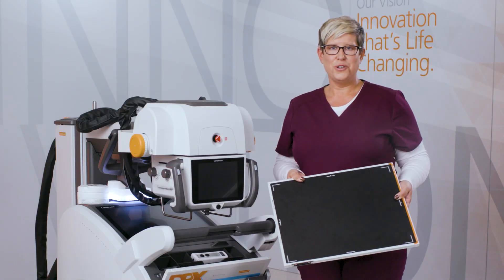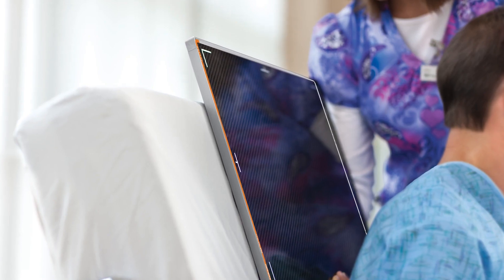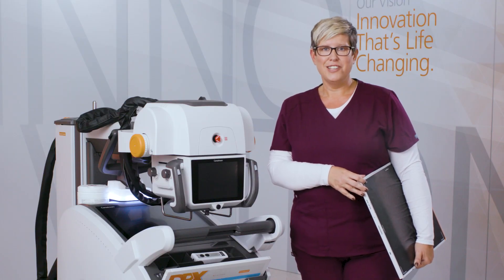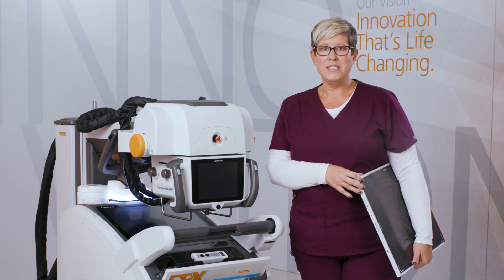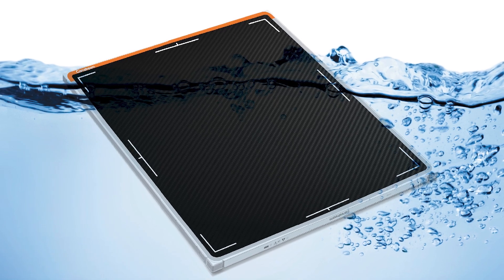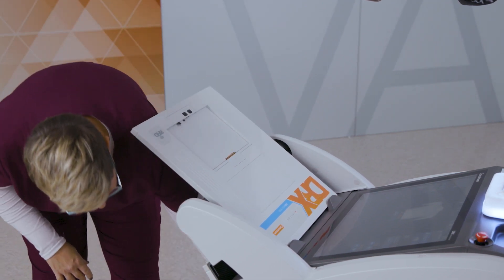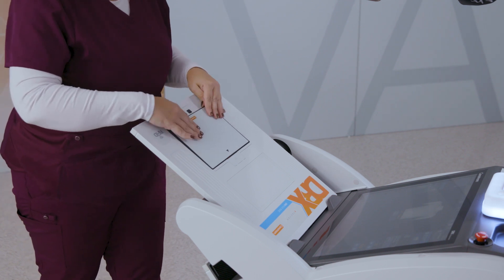At just over 3 kg, they can hold up to 170 kg when weight is distributed evenly over the detector. With the addition of a weight cap, up to 590 kg can be supported. They have an IP rating of 57, which means there is a high protection against dust and liquid intrusion. To keep workflow moving, the DRX Plus detectors have a battery hot swap feature, allowing the technologist to change the battery without having to reboot the detector.